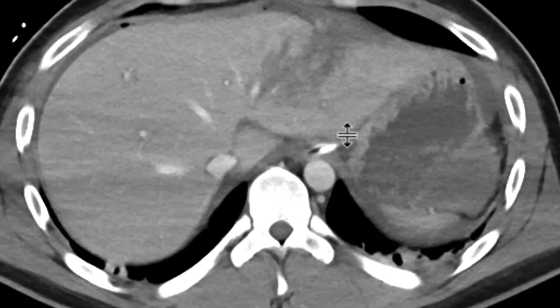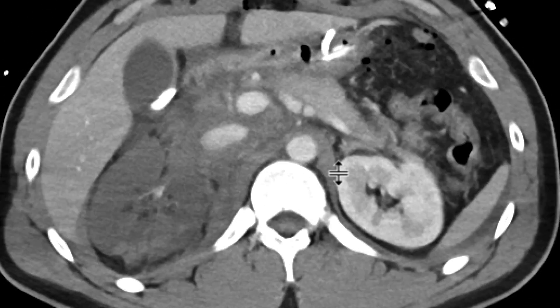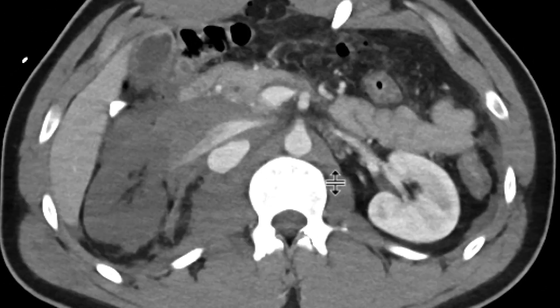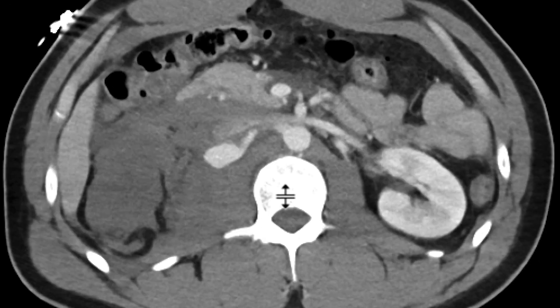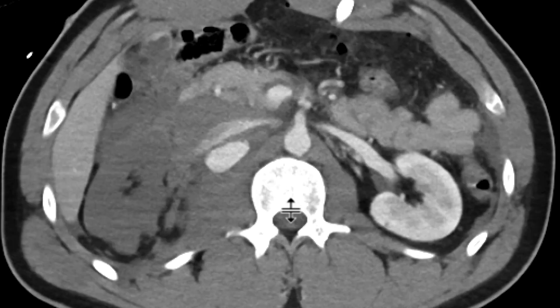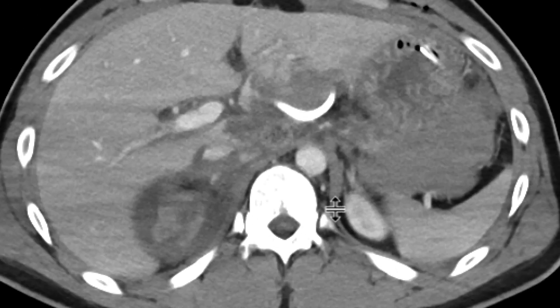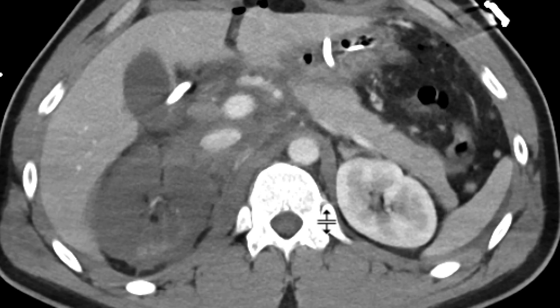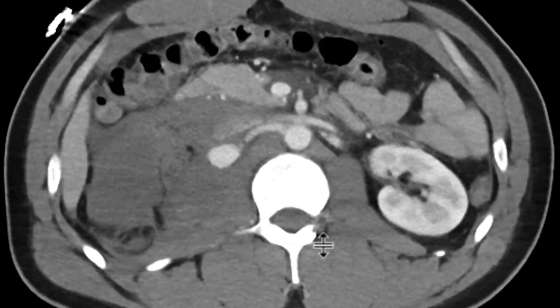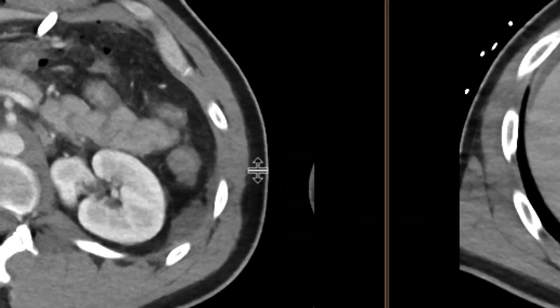Additional hemoperitoneum is seen elsewhere. The reason I wanted to show this case was — in addition to all that — we'll follow the right renal artery. We can see that it comes off the aorta into this contained collection of contrast and then fistulizes to the IVC. This is an example of a post-traumatic right renal artery to IVC fistula.